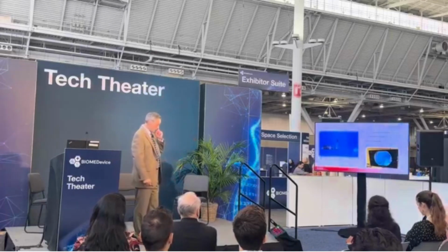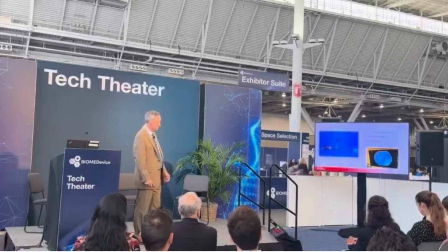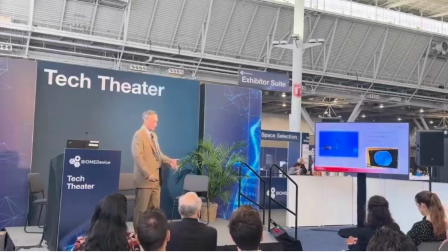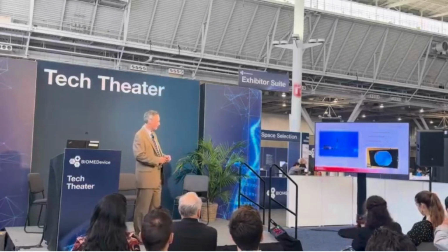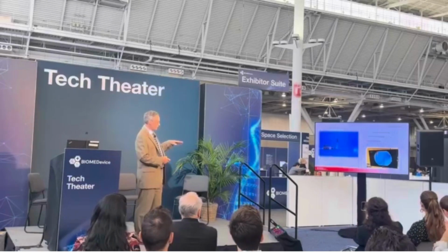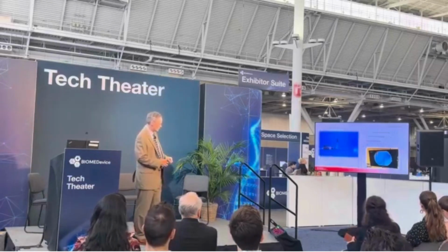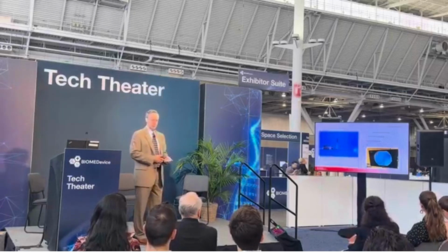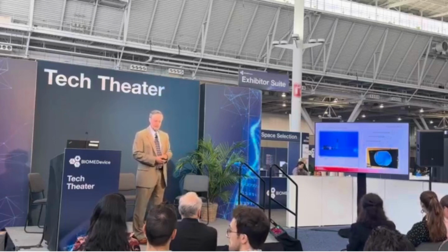With the standard arthroscopic scope, we've got 3 different angles. There are some products coming out that are smaller and articulated, and you can see different angles. They're not quite there yet. There are some helpful hints. Down on the lower right, there's a little arrow on that image. That's the direction of view, the direction that the camera is actually facing.